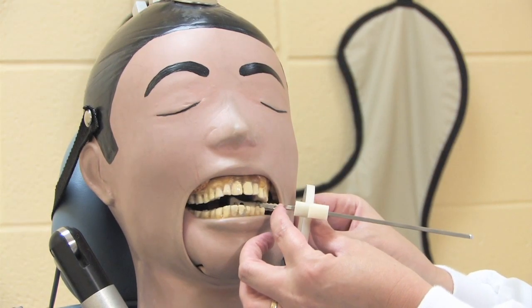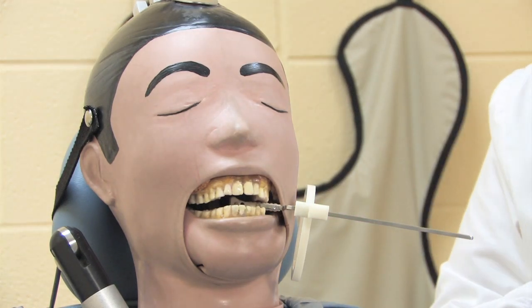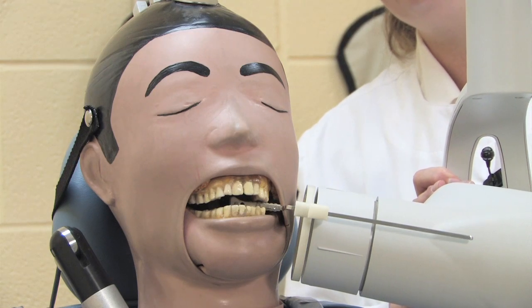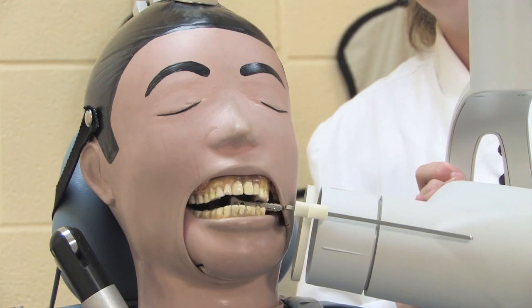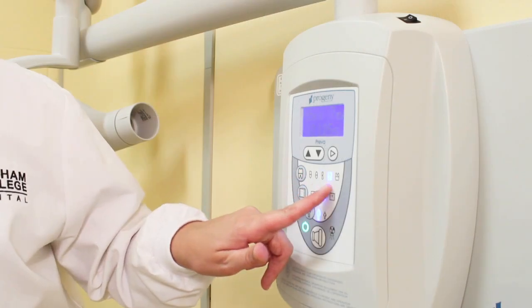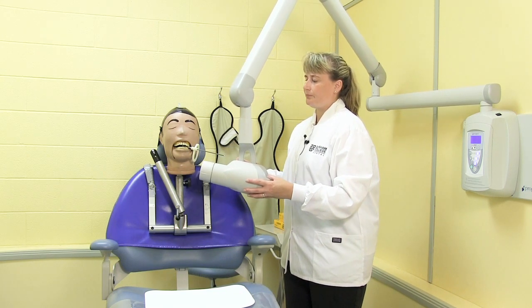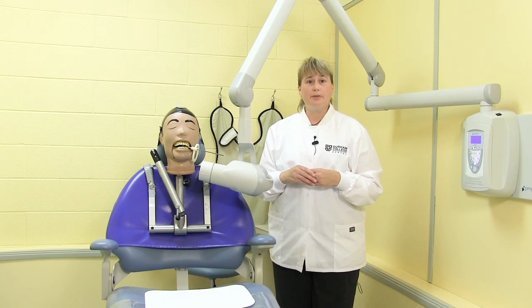The ring is brought close to the client's skin surface, but not touching. Tube head and PID are positioned flush with the ring for correct horizontal and vertical angulation. And select the correct tooth icon for this exposure and exit the room for exposure. This is posterior periapicals for the paralleling technique.